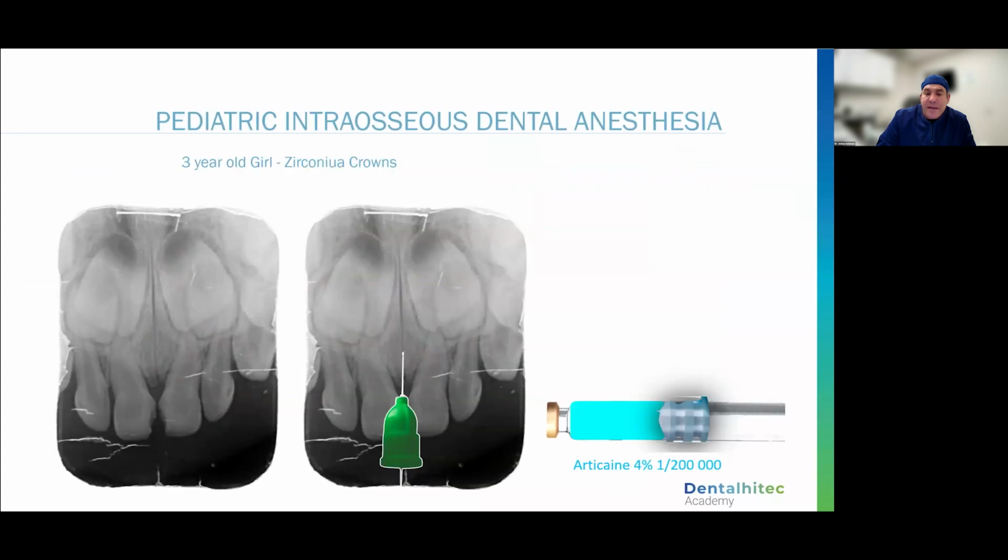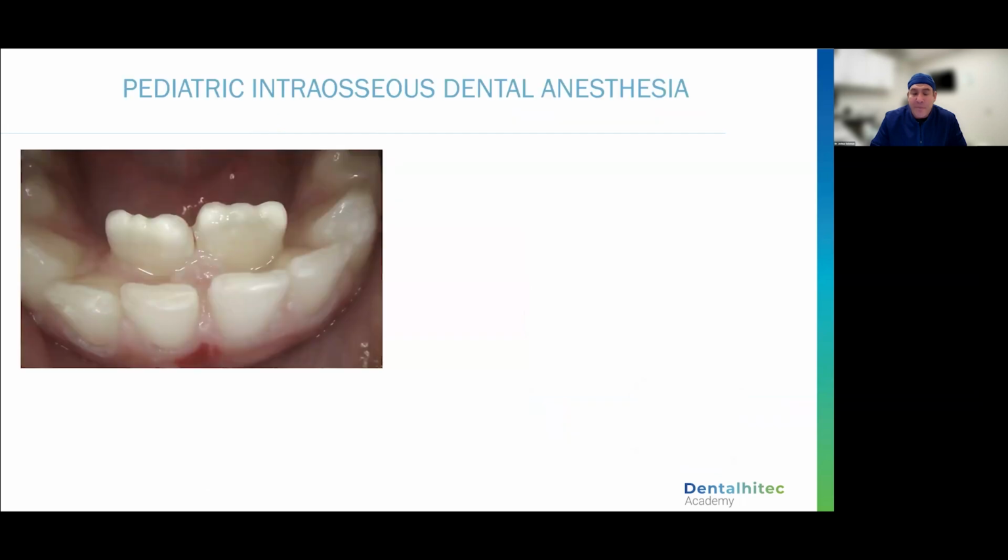I want to skip ahead and talk about bone level. Okay. We do not want to give an injection without having a radiograph. And the reason why is, number one, I need to make sure that I'm passing my needle in an area where there's no other tooth structure or other anatomy. There's not a supernumerary tooth, and that I have an adequate level of bone.